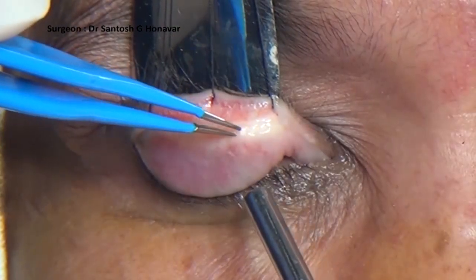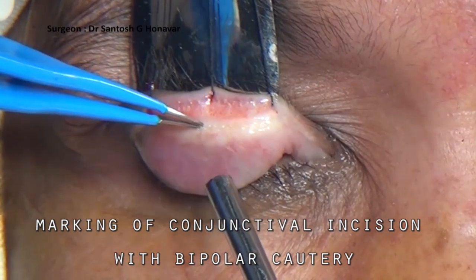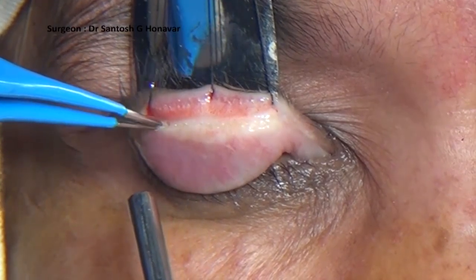The eyelid is averted over an eyelid spatula and the marking for incision is made using a bipolar radio frequency electrode, 4mm from the lash line.